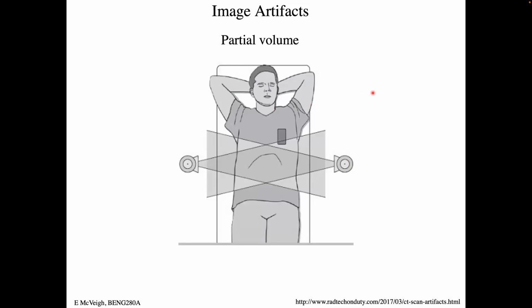You can see also that for these modern CT scans, where we have a detector that has many slices in Z, right? Remember that this is an exaggerated detector. This is a really thick, long detector, right? But it has, say, 320 slices in this direction. When the source projects through at this angle, we illuminate or cast a shadow from this part of the body. At 180 degrees, we cast a shadow from this, and they don't match, right?